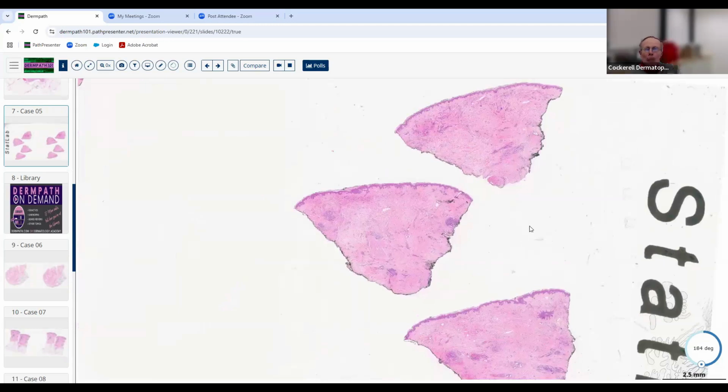And here we've got a punch biopsy, and it probably clinically looked like a red diffuse area. They probably were concerned about the possibility of maybe cellulitis or something like that. In this specific instance, they may well have been worried about recurrent metastatic breast carcinoma. So that may have been what they were thinking about here. I don't have the clinical information submitted in this case, but chances are it was probably one of those two things.